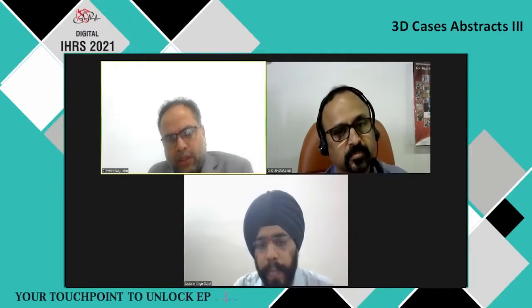It's just an observation. You had inducible VT1 and VT2. Yes, sir. If you compare the morphologies, the VT2 is a close match to your clinical VT, but not identical. Yes, sir. And when we finally look at your ablation pattern, it looks more like a substrate modification rather than isthmus ablation. Do you agree, or you can disagree with me? But just looking at that, it looks more like a substrate modification.